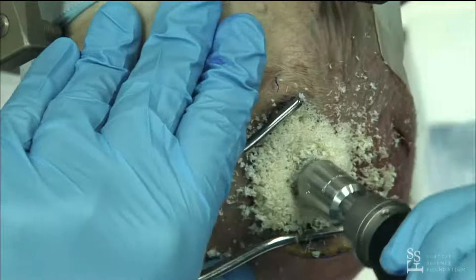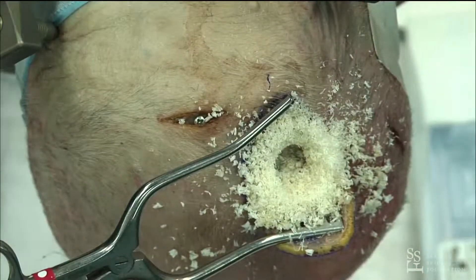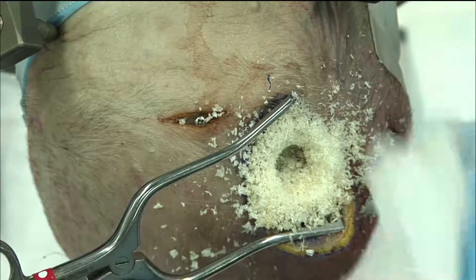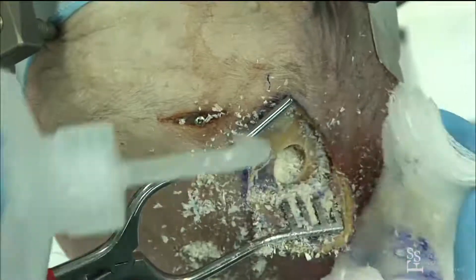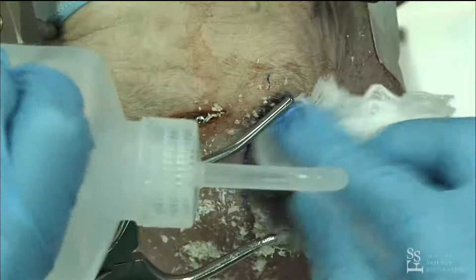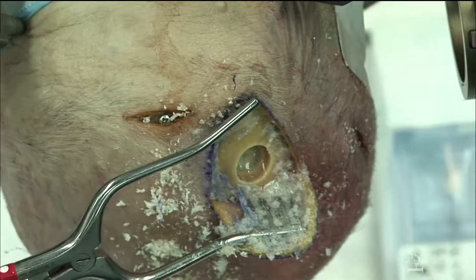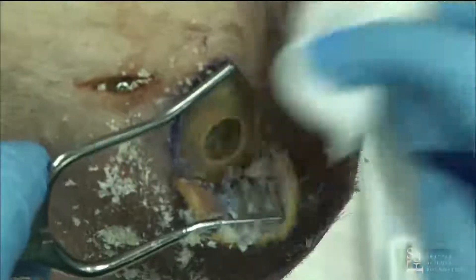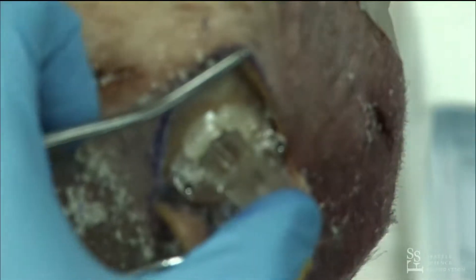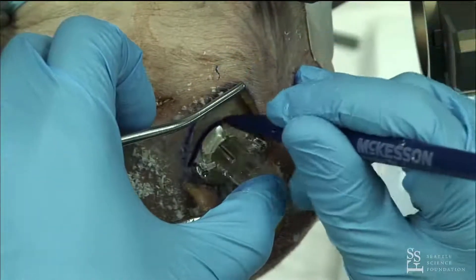Get some irrigation, get some of that stuff off. Maybe a wet sponge will be a good way to start. Now we've got our bone dust off just so we can create more bone dust with our countersinking. This device has been around for a while but it has a profile — and if you see somebody who's been countersunk versus not countersunk, it makes a huge difference.